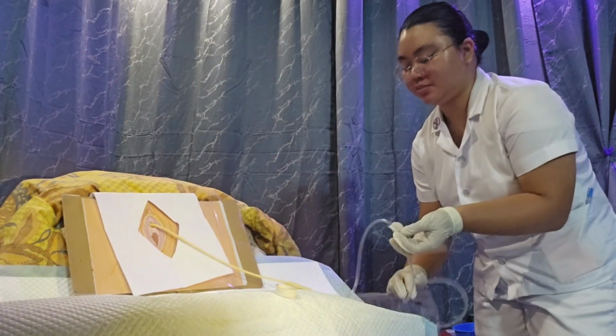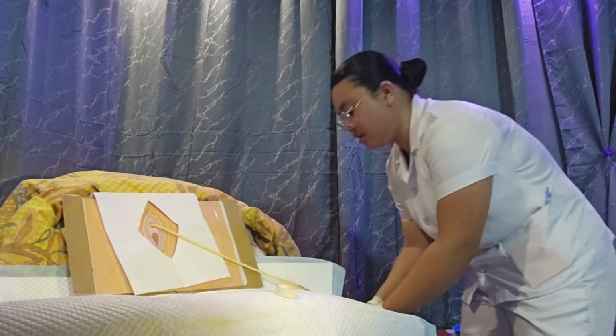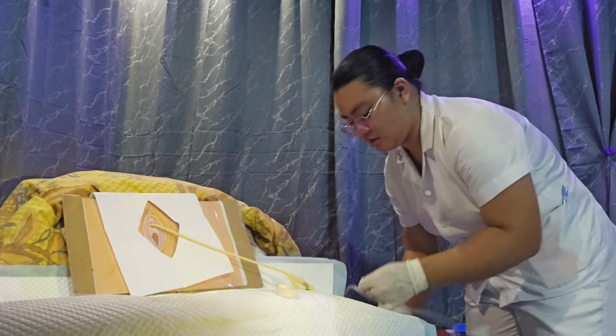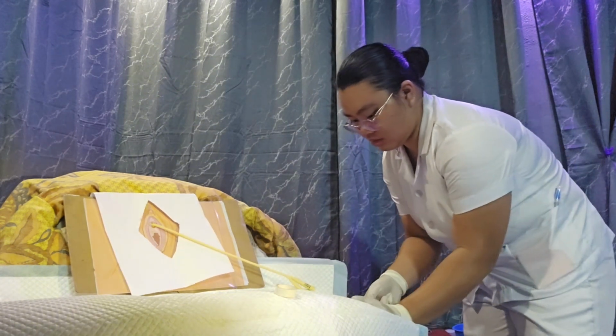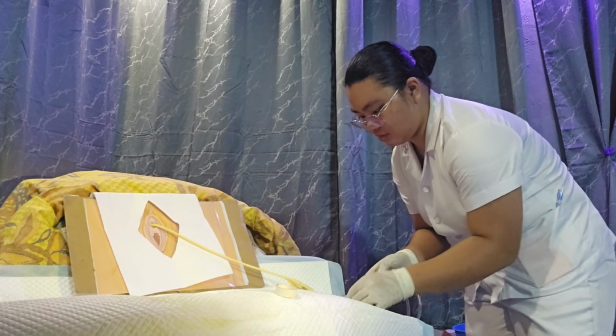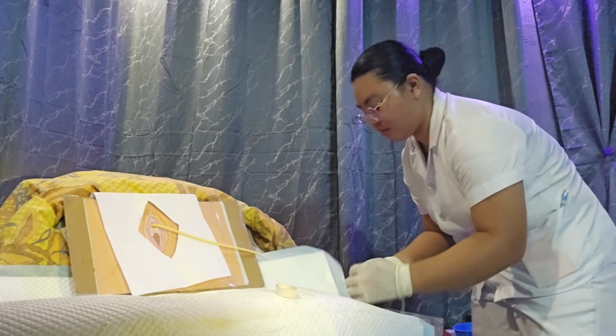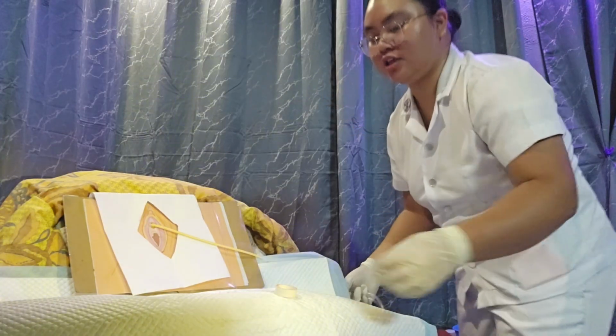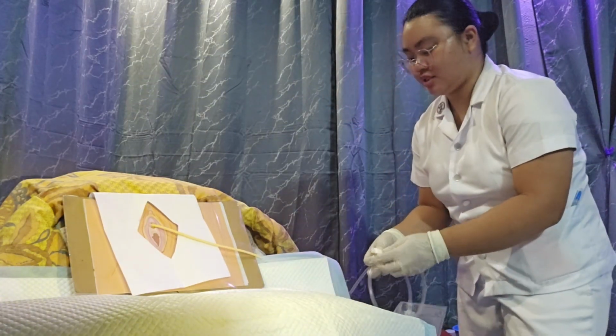So assuming that the patient's thigh is in this area, we're going to tape it, taping it securely to prevent slipping off.